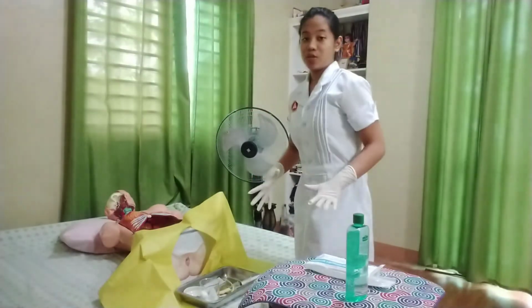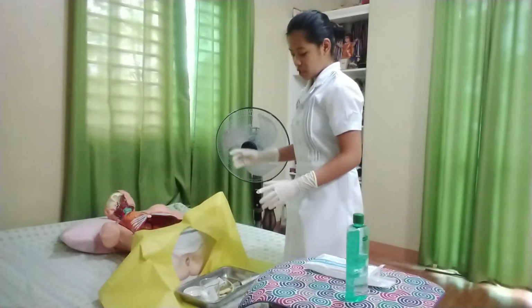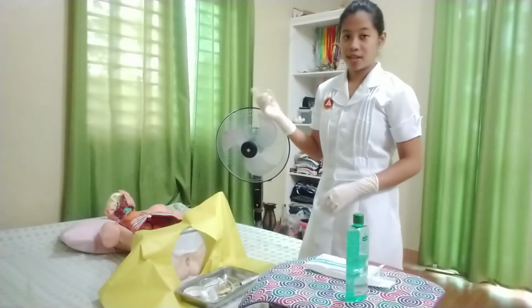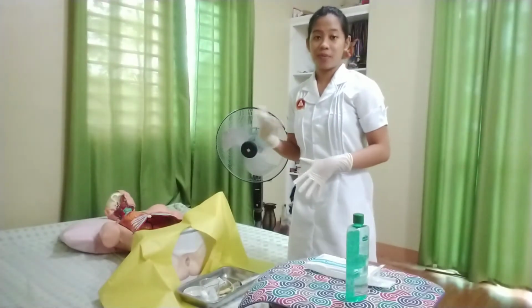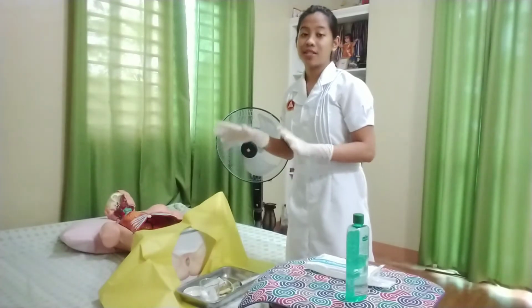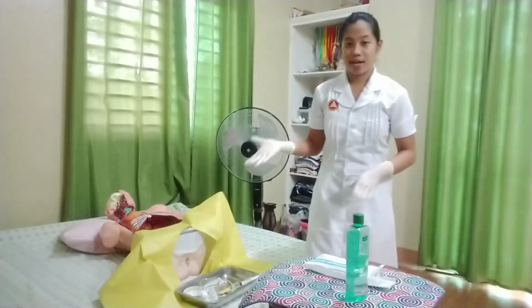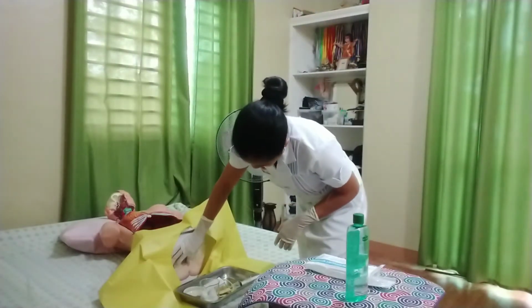Now I will proceed to the catheterization of the female. So first, using the thumb and one finger of my non-dominant hand, I will be spreading the labia and identifying the meatus. And I will keep spreading the labia until the urine flows well and continuously. So let me just spread it.